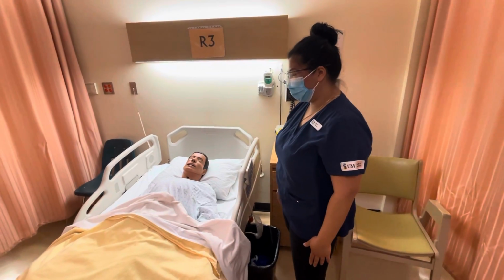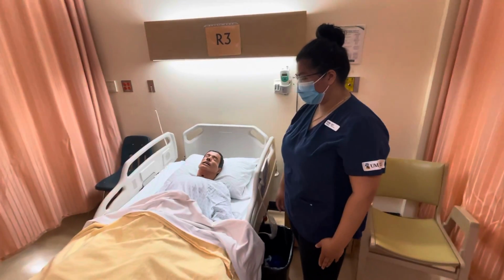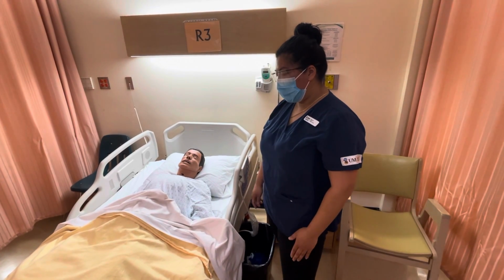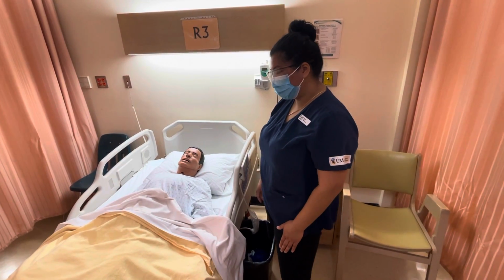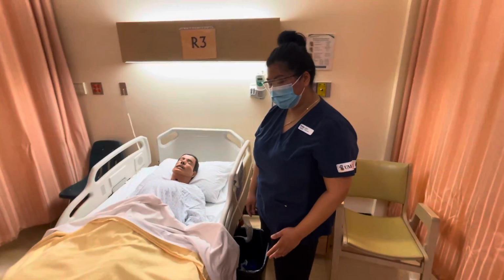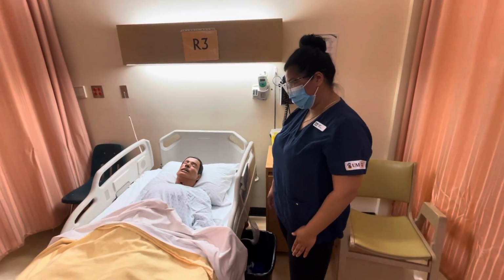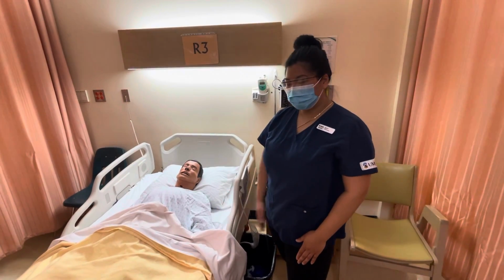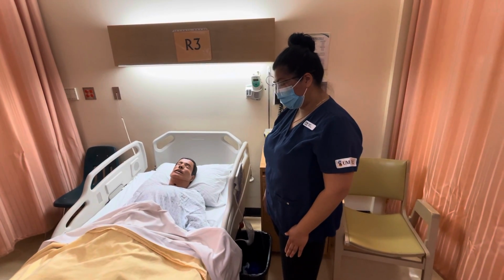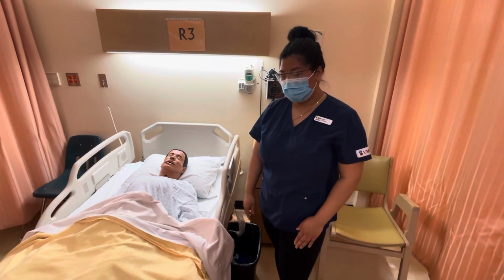So, Ms. Maragamo, we're going to change your dressing on your left side. So what I'll do is I'll take out the old dressing and assess it for any drainage. And then I'm going to clean the wound and assess the wound for any signs and symptoms of infection. Make sure the wound bed is healing normally. And then I'm going to cover it up with a new dressing. Does that sound like a good plan to you? Our patient gave us consent. And do you need any pain medication for the procedure? No, you don't? Okay, so our patient doesn't need any pain medication.